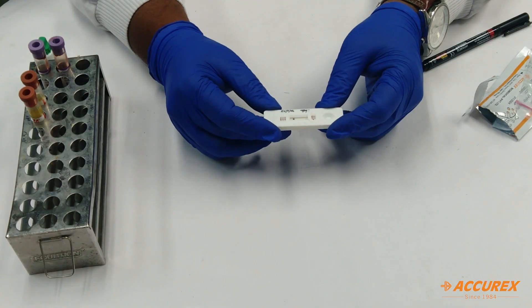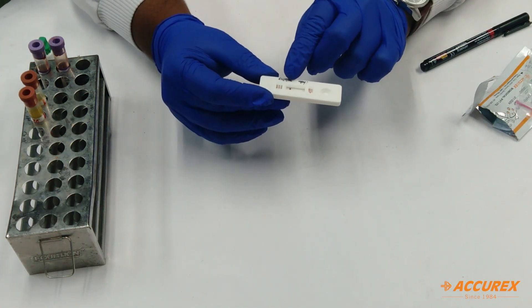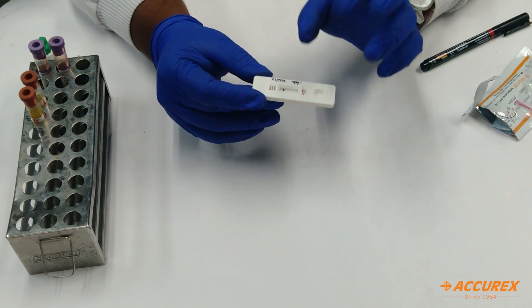So now the 20 minutes have been completed. You can see the result. So the band has appeared near the control line and there is no band appeared at PV or PF. It means the test is negative.